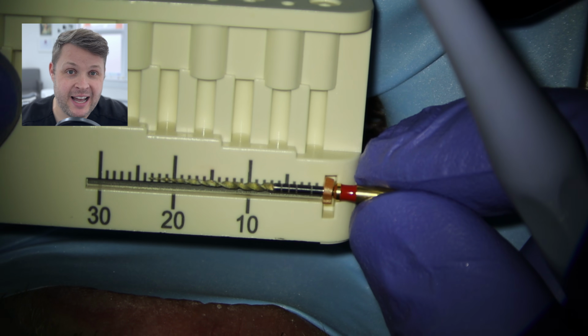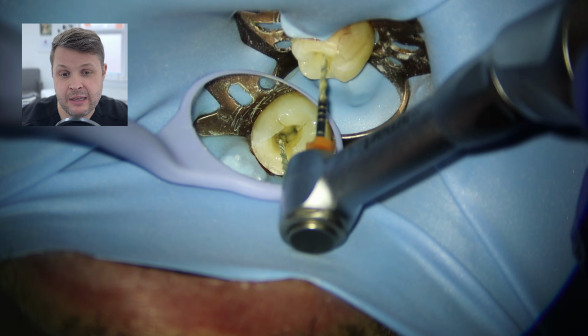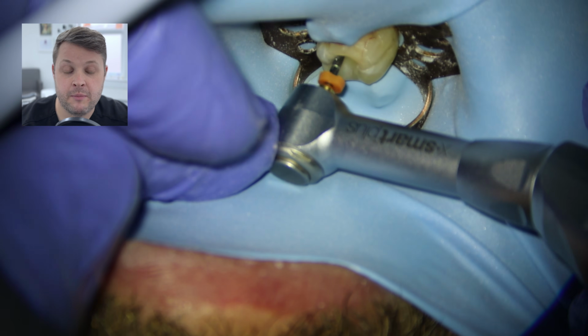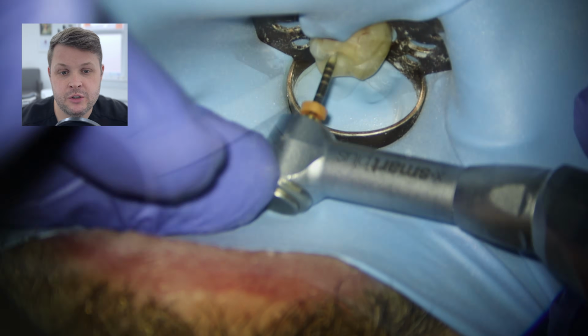It's obviously going to be a higher diameter. In this case, it's going to be a size 25 variable taper high flex file, and this is going to be again shaped minus 0.5 millimeters away from the 0 reading on the apex locator. And there you have it, mesiolingual, done and dusted.